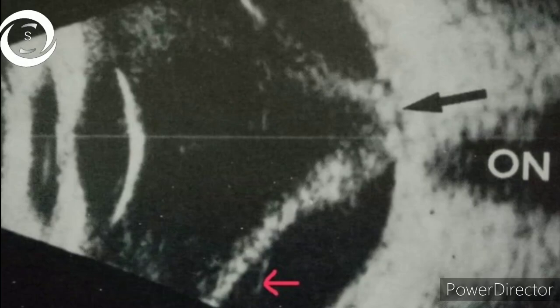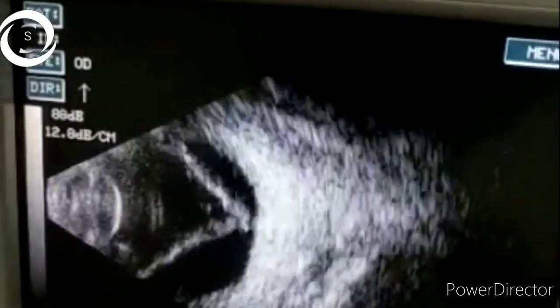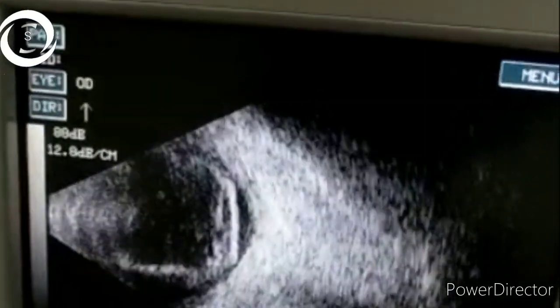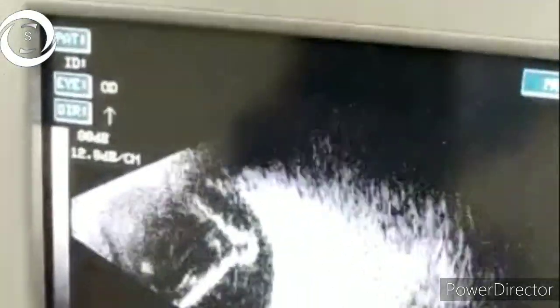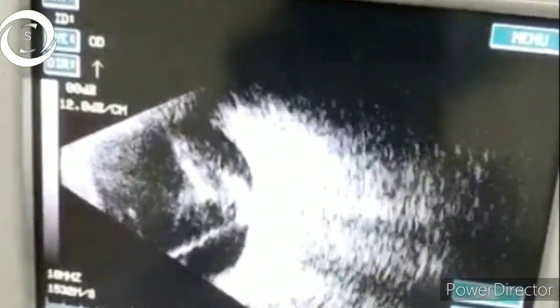In the fifth dynamic B scan, you can appreciate the thick, highly reflective membrane moving with changing the position of the probe. It is open funnel-shaped and was visible even at 40 decibel gain, whereas PVD will generally disappear at that gain. So this is open funnel-shaped retinal detachment.